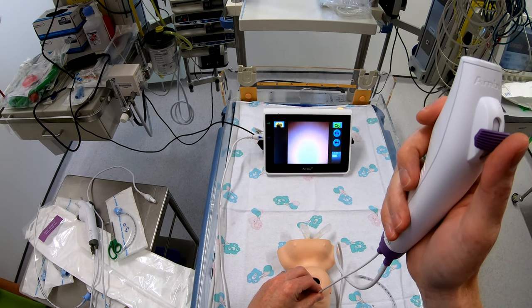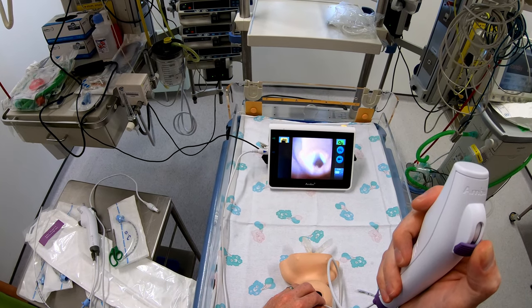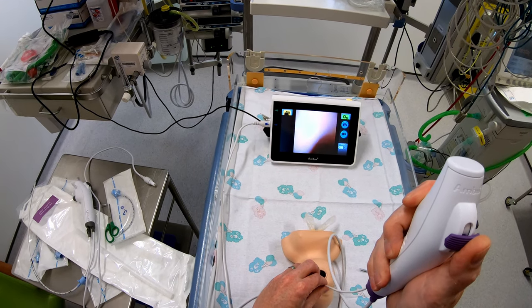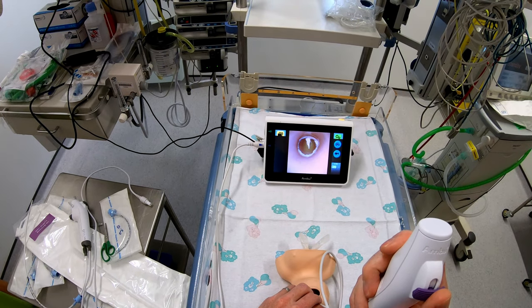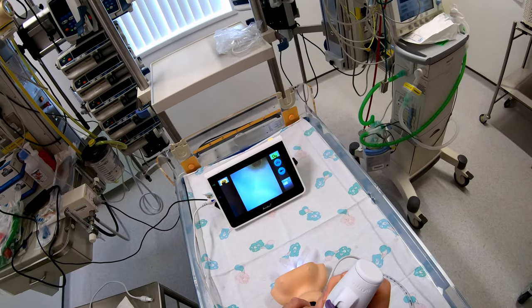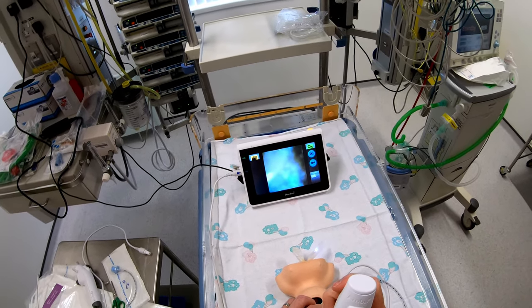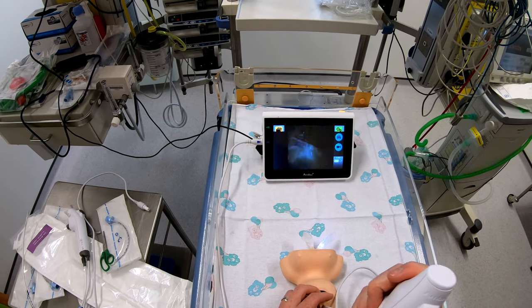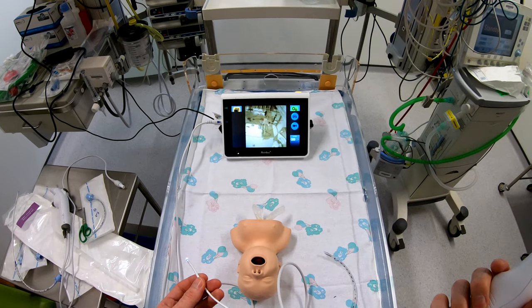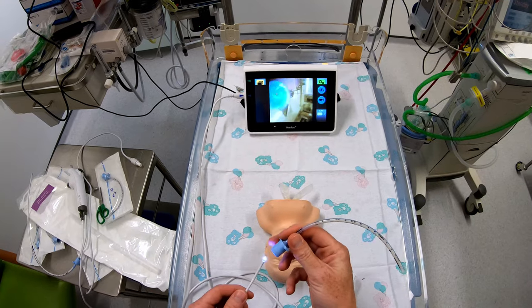The image quality is looking pretty good. There's the laryngeal opening, all the way down to the carina. First impressions: I've got good control of the tip, a nice image quality, and it seems to work fairly well. So let's see how it performs for doing an intubation.